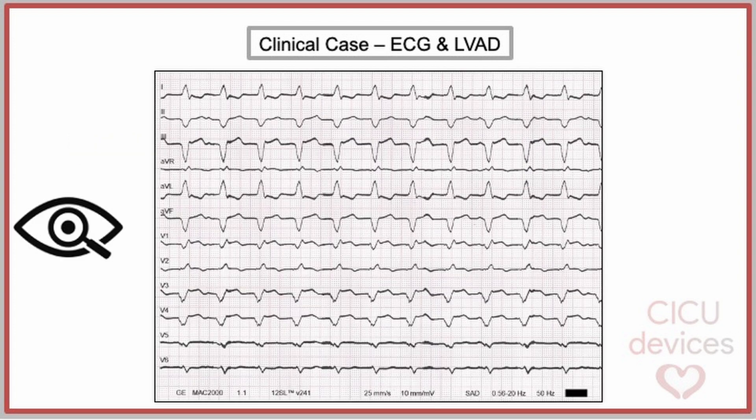If we carefully read the recording, we can detect certain data that may guide us toward identifying the type of LVAD. First, we confirm that it is an ECG recorded at 25 mm per second, with an amplitude of 10 mm per millivolt, a high pass filter of 0.56 Hz, and a low pass filter of 20 Hz.